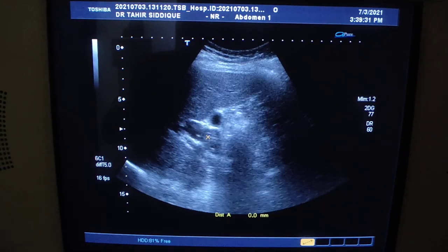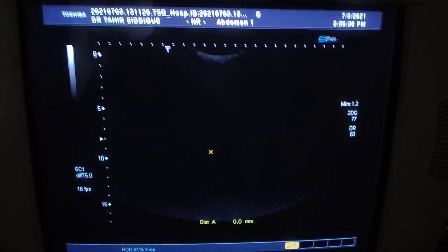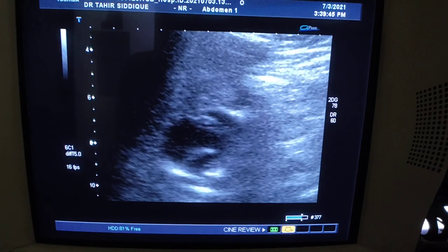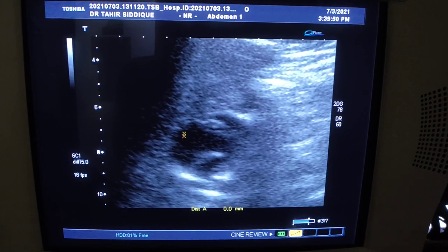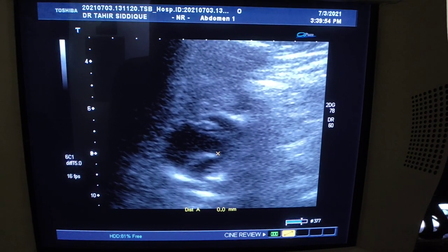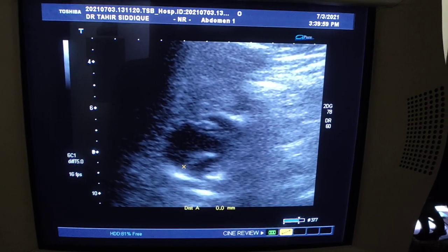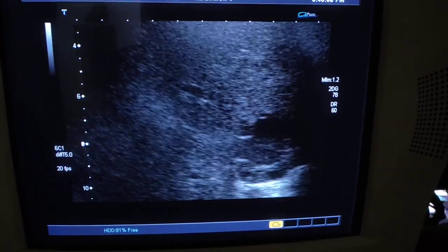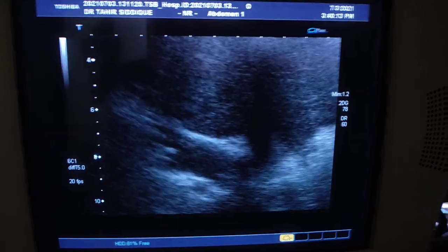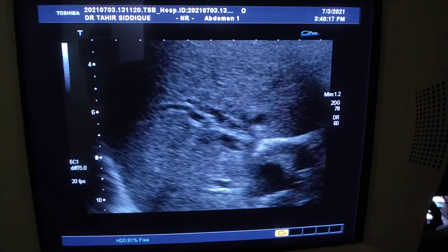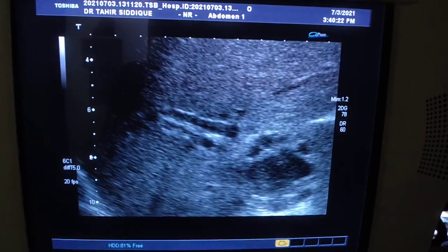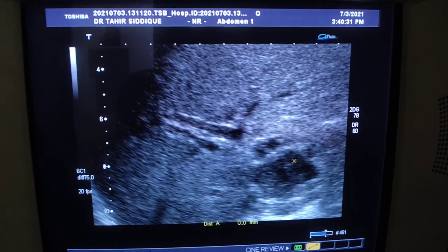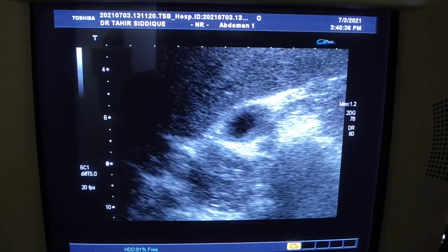Moving towards the region of the porta hepatis with this dilated CBD, you can see a globular cystic area. This relates to the distal end of the common bile duct. This is the portal vein. There is mild intrahepatic bile duct dilation. These are the dilated intrahepatic bile ducts, and this mass relates to the common bile duct — just the common bile duct.